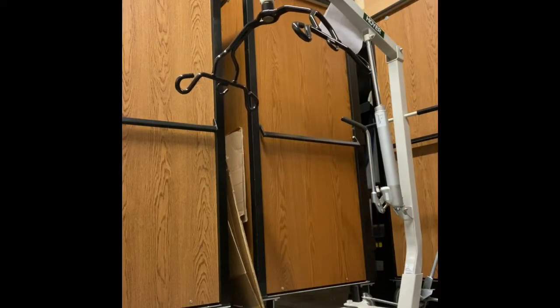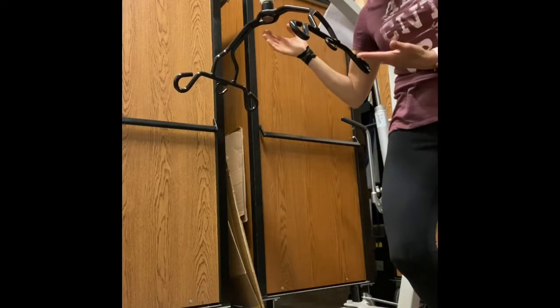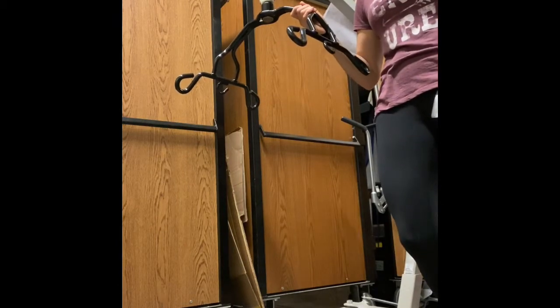Hi friends! I'm going to introduce you to my friend the Hoyer Lift. This is a back saving piece of equipment.